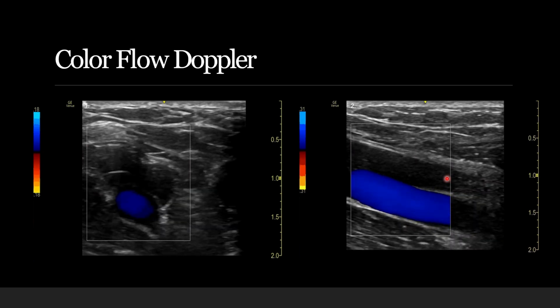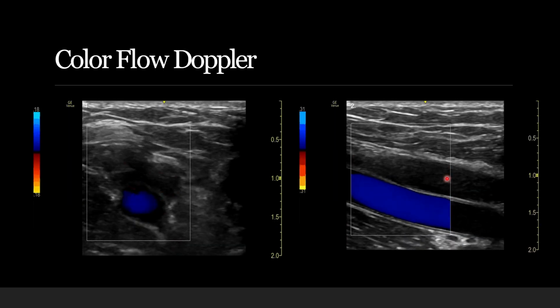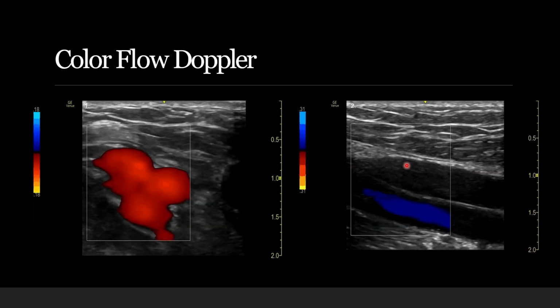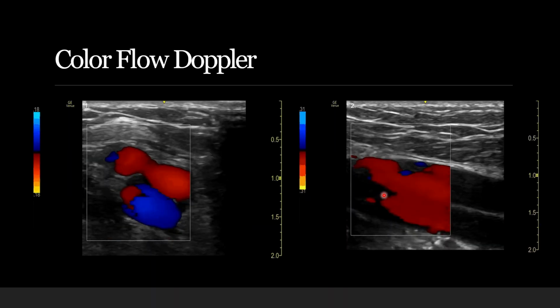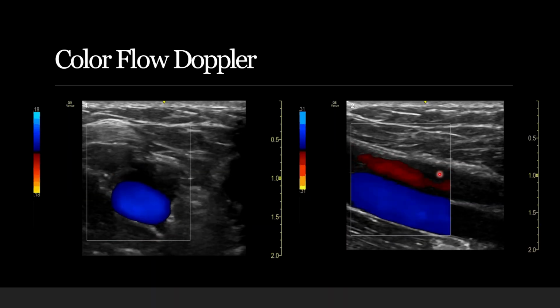So similarly, I'm squeezing my hand, or having a friend squeeze my hand or my forearm, and that's causing that increased Doppler shift. So we're getting some flash and change of flow. We're able to demonstrate which of these structures are pulsatile arteries and which ones are veins.